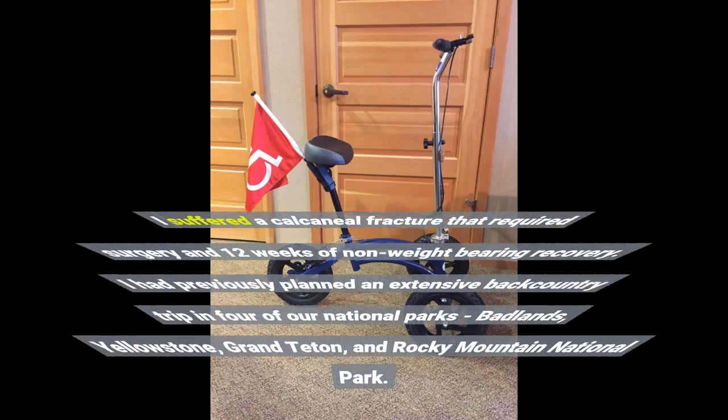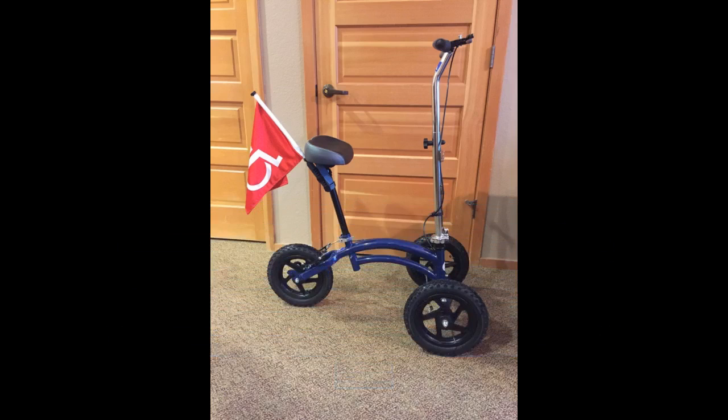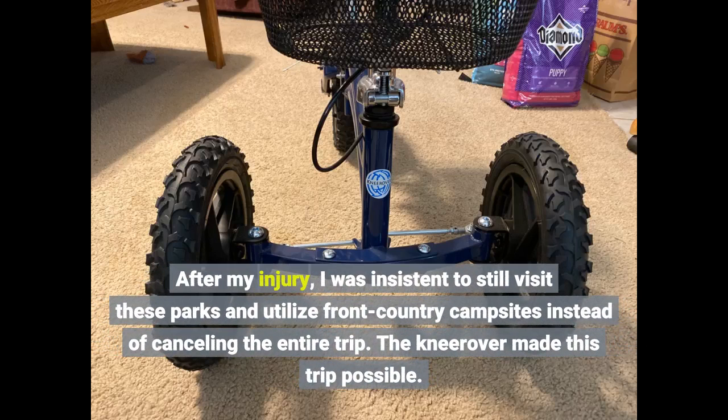I suffered a calcaneal fracture that required surgery and 12 weeks of non-weight-bearing recovery. I had previously planned an extensive backcountry trip to four national parks — Badlands, Yellowstone, Grand Teton, and Rocky Mountain National Park. After my injury, I was insistent on still visiting these parks and utilizing front country campsites instead of cancelling the entire trip. The KneeRover made this trip possible.